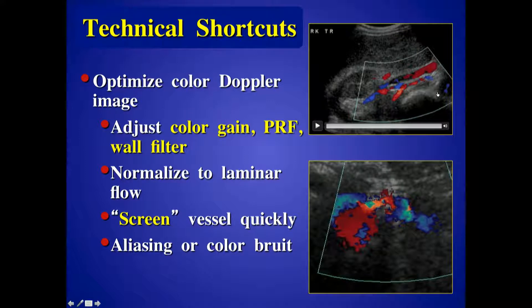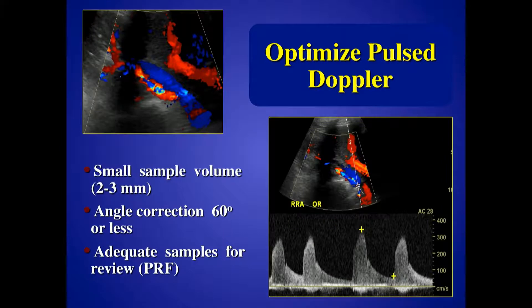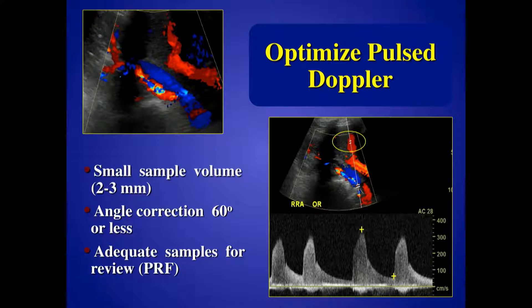By adjusting your PRF and looking for flow disturbances, you're able to easily see aliasing when it occurs. Here's an example of focal aliasing at the origin of the left renal artery, which tells you there is likely a stenosis there, particularly when it's paired with a color bruit artifact. Also make sure the sample volume is relatively small — just in the lumen — so you're not getting conflicting signals or overlapping waveforms.